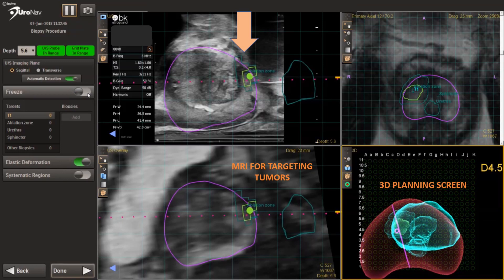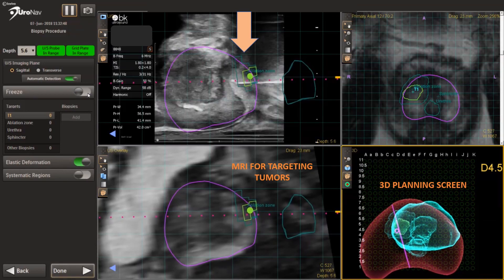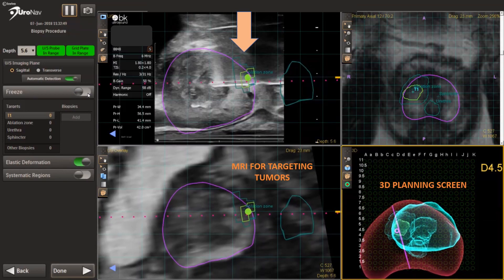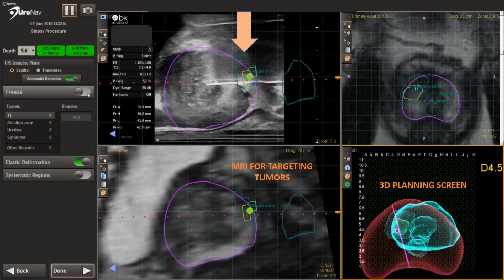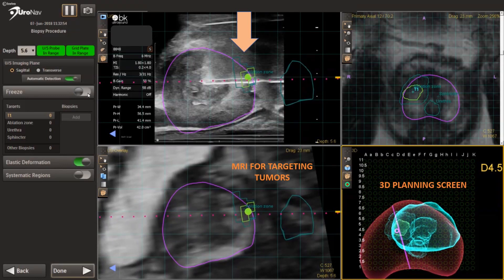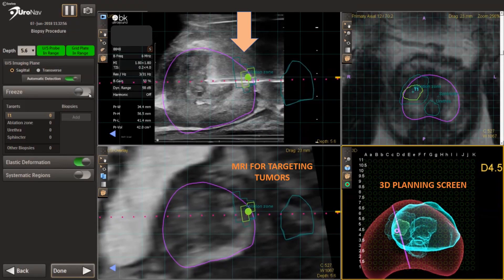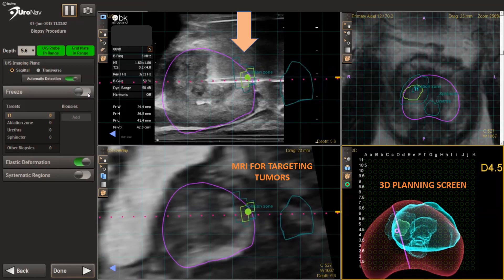In this video, you can see here on the top of the screen in the center, a cryo-ablation probe being placed through the lesion, as well as the intended ablation zone. We're able to record the locations of the needle placements, as well as place additional needles for adequate coverage.